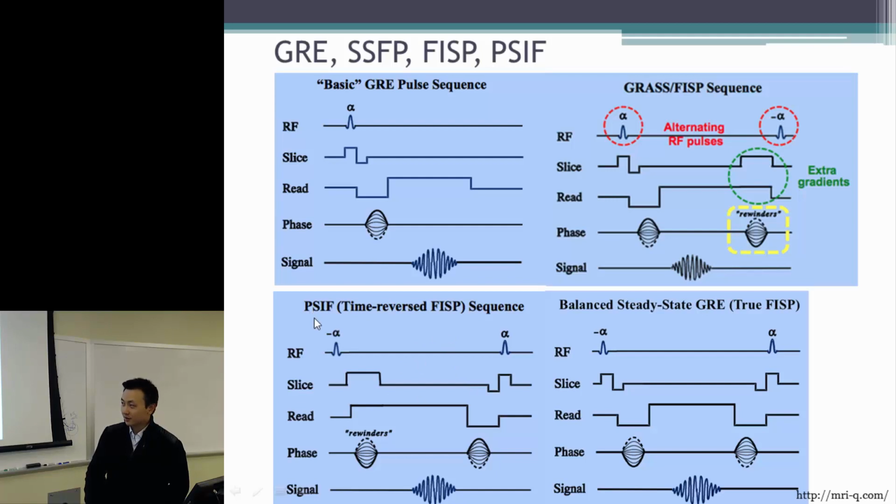So it's basically the inverse of this FISP sequence. It's totally just the inverse. It's very interesting. So it collects the FID signal in here. And if we balance these gradients to make all the gradient moments sum to be 0, we have this SSFP signal.